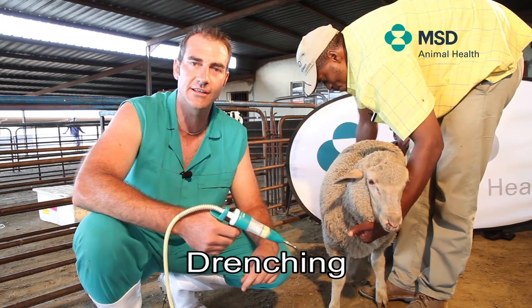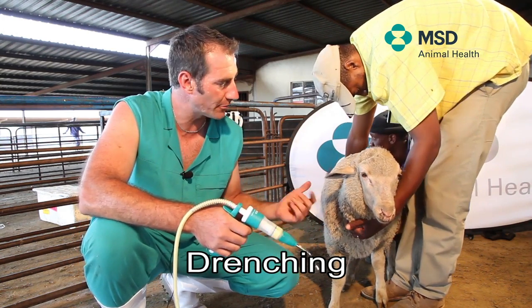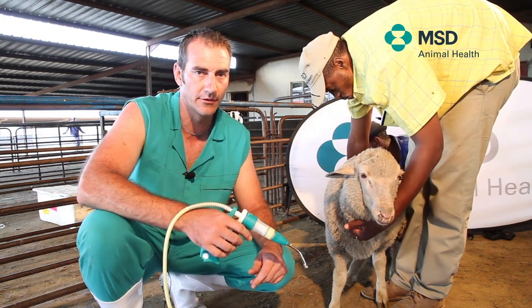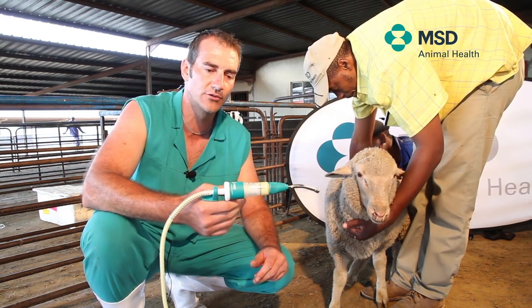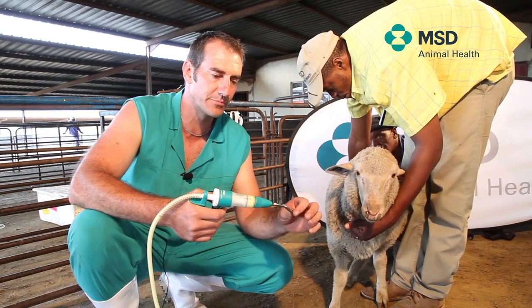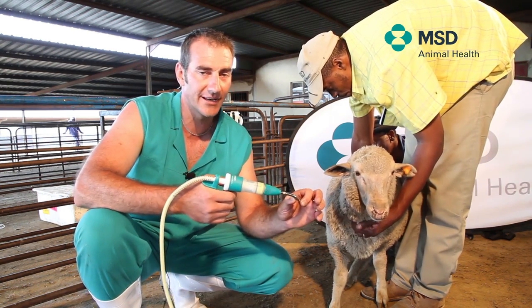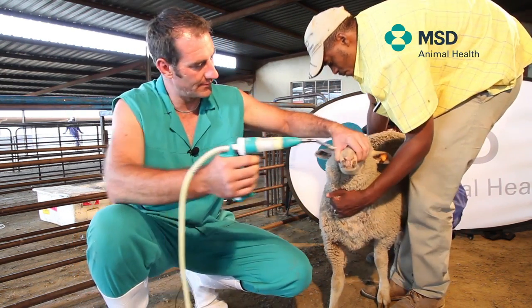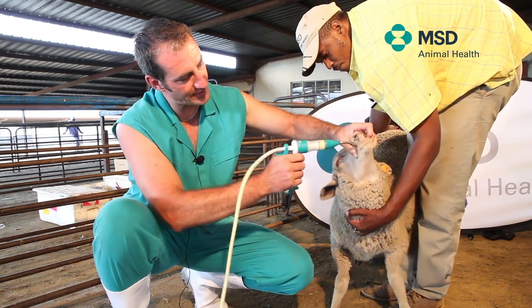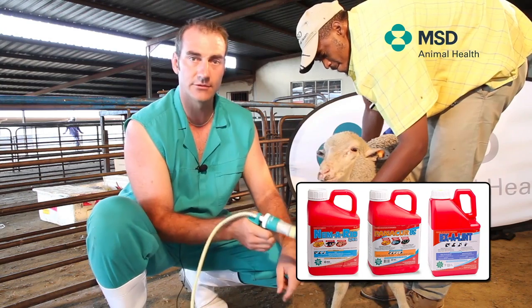The next technique I'm going to demonstrate is drenching in the sheep. Make sure that the animal is properly restrained to minimize stress. Make sure that the dose gun you're using is correctly calibrated and free of spurs or any hooks that might injure the animal in the drenching process. Insert the nozzle facing to the cheek side, drench, and make sure that the animal swallows.